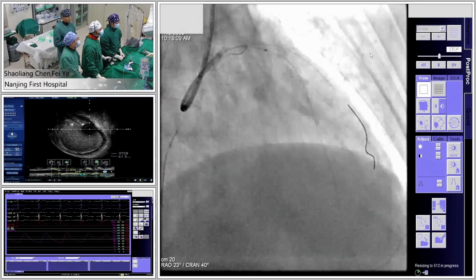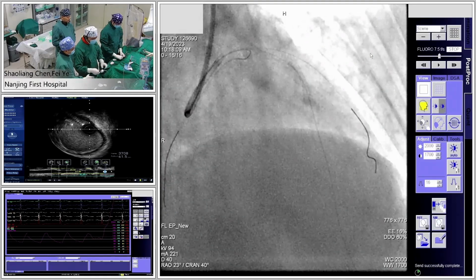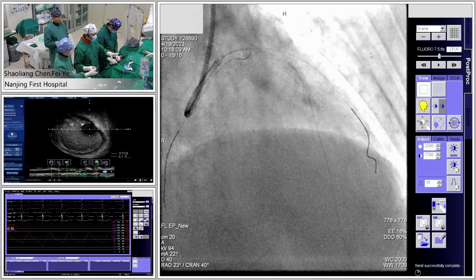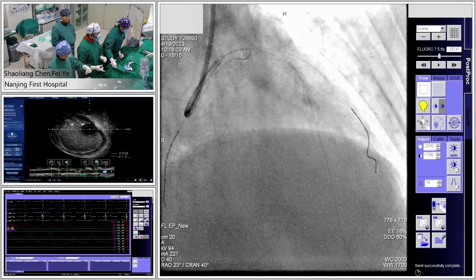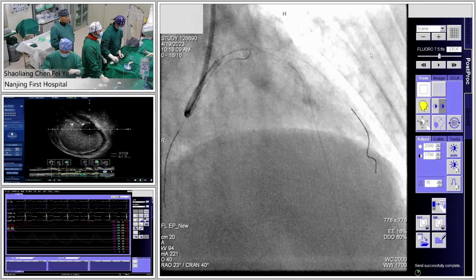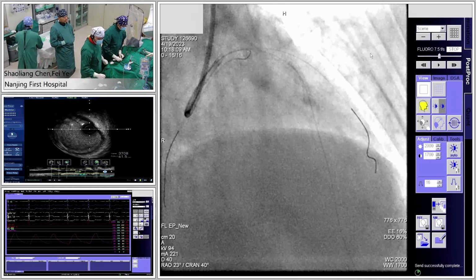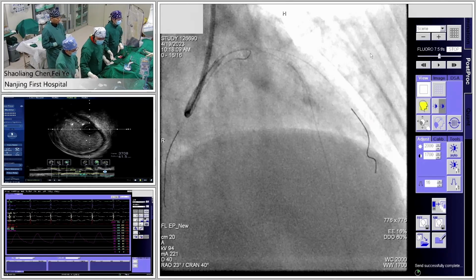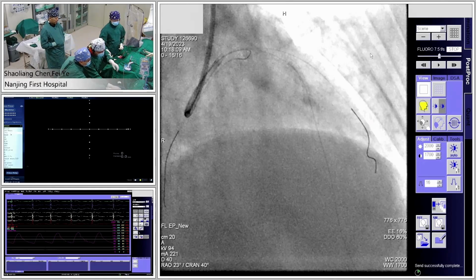After the 29 millimeter stent, what's the next stent length? The diameter should be 3.5. The first stent was 29 millimeters. So I think you can use the IVUS to measure from the proximal stent edge to the middle left main. IVUS, please. Show me the last angiogram.